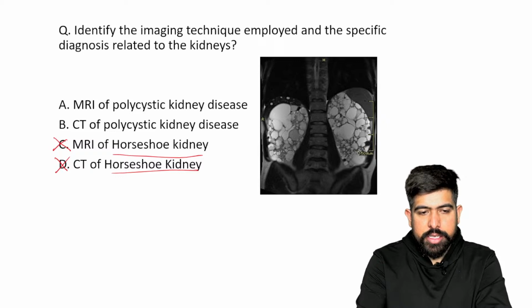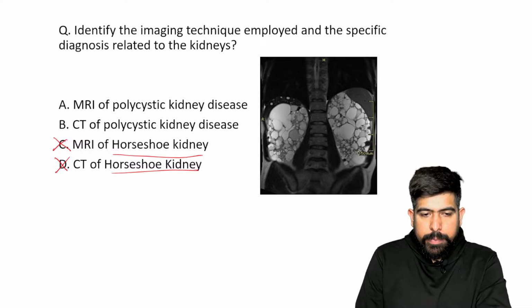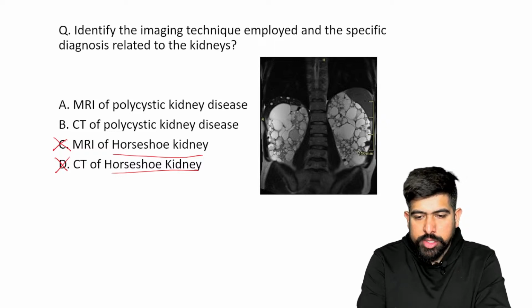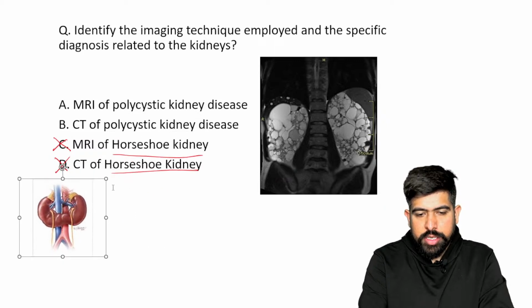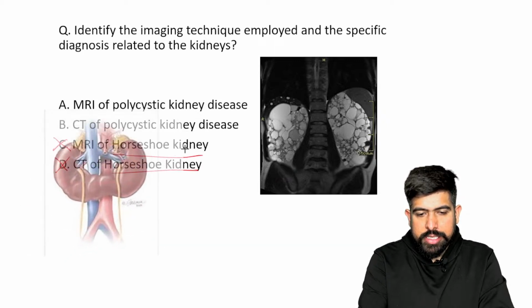Horseshoe kidney. I'm showing you the image also, how horseshoe kidney is seen. Can you see this image?